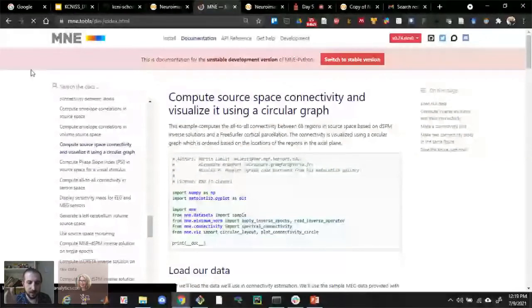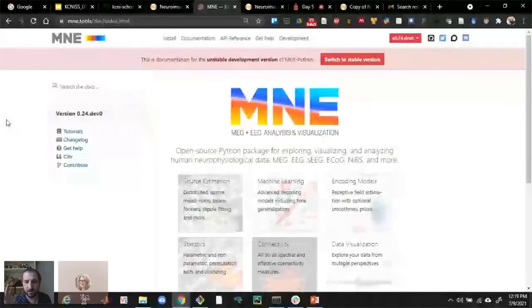This is another neuroimaging analysis tool, and there are a lot of players in the space. There are a lot of software libraries that have been around. If we're talking about EEG and MEG specifically, the old school, OG tool is EEGLAB, and then others like that are commercial, like BESA and Curry.